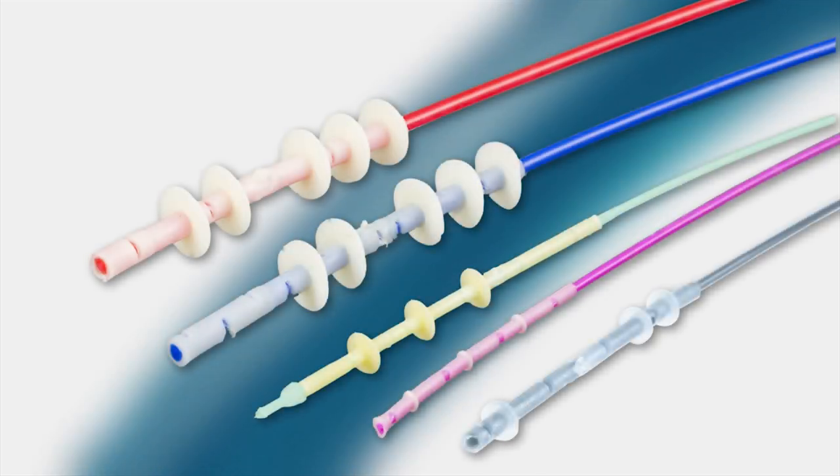The pull-through cleaning brush range covers channel sizes from one millimetre to eight millimetres.